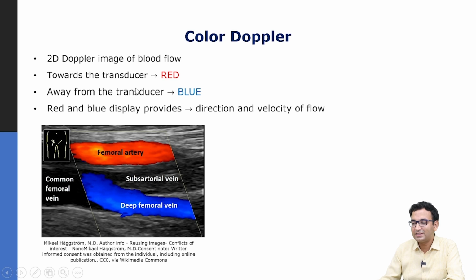Now, this is very interesting because you may have read about Doppler effect in physics, and in physics you have red shift when the structure is going away and blue shift when the structure is coming towards us. For example, we know that the universe is expanding because you have red shifts in the distant stars. So, interestingly, the convention is opposite for ultrasound and for astrophysics, but nonetheless for historical reasons this is the convention which is in place and which is being followed.